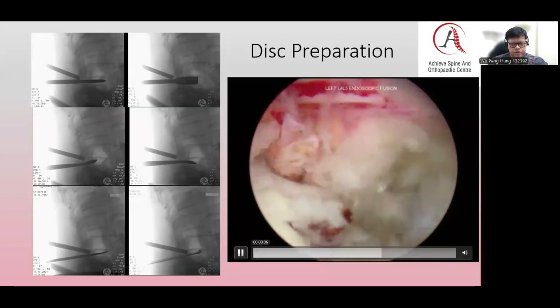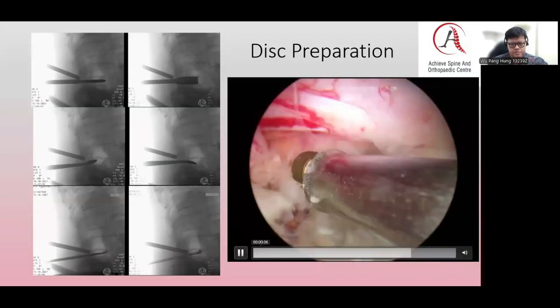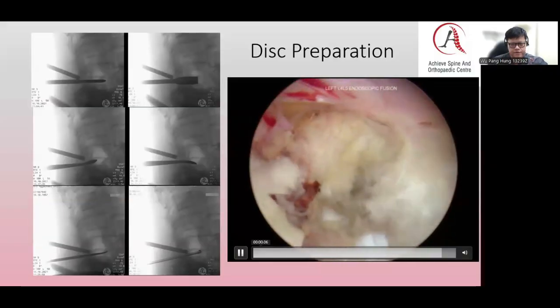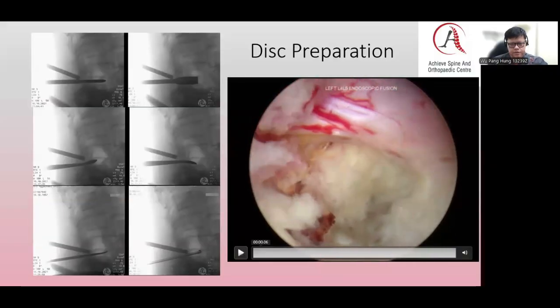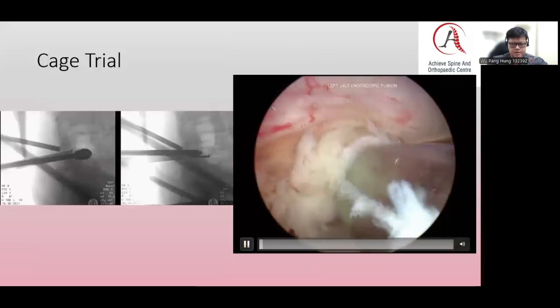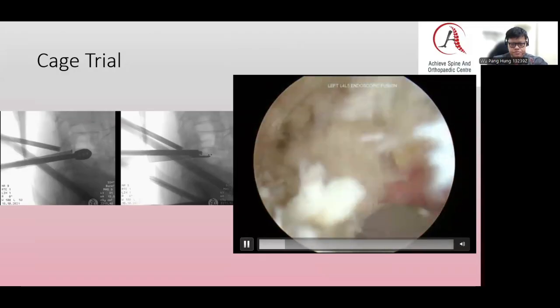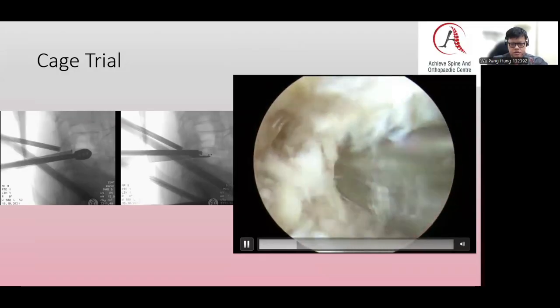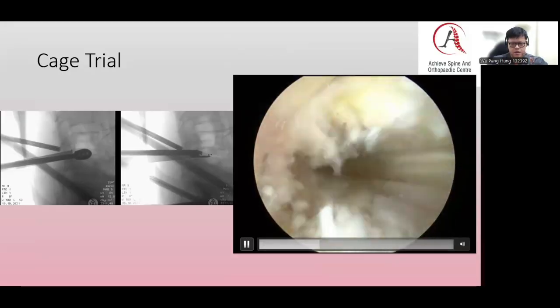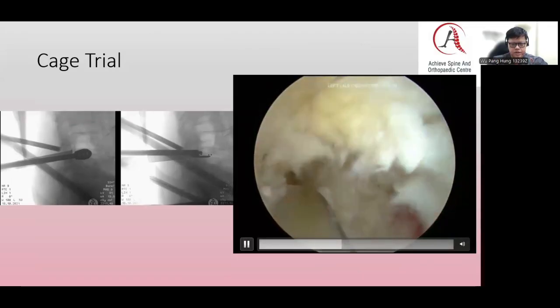Then we can do a thorough disc preparation. Throughout the process, you will be visualizing the traversing nerve root. In some of the cases where we are doing a far lateral approach, we can also visualize the exiting nerve root. Then using a blunt instrument, we can prepare the end plate. The advantage of endoscopic fusion is that you can see the end plate preparation very clearly.